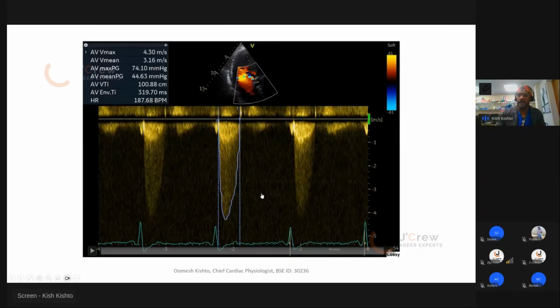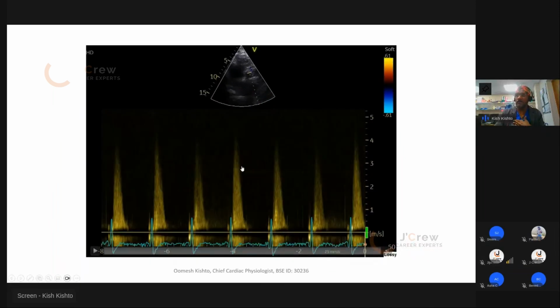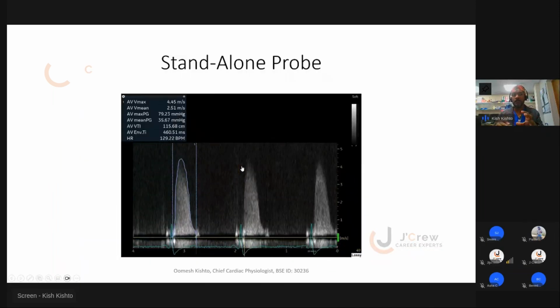You can get it nicely. Subcostal, you can get it. Right sternal edge here as well. So there are all different places that you can try. At least what you're showing here is you've tried all these different places, and if you couldn't get it in one, I'm sure one of them will give you some good data. So don't just try on one plane, apical 5 chamber view, and if you haven't got a good line, so yes.